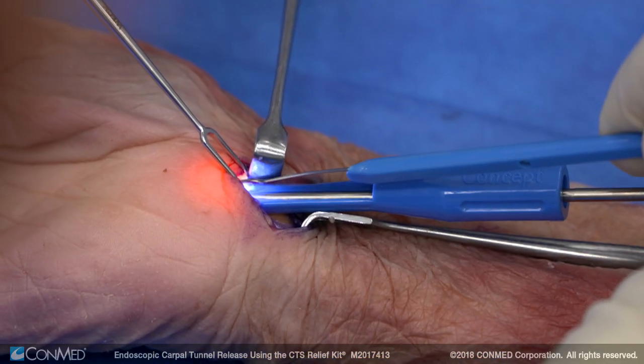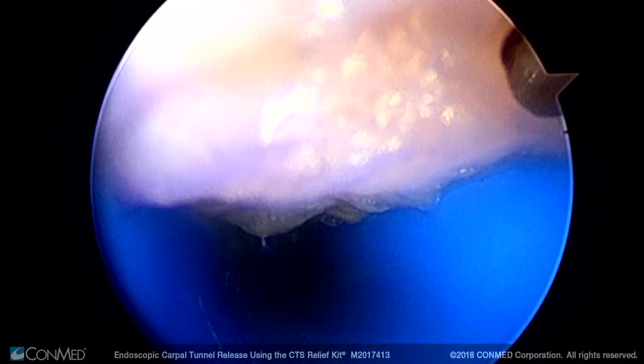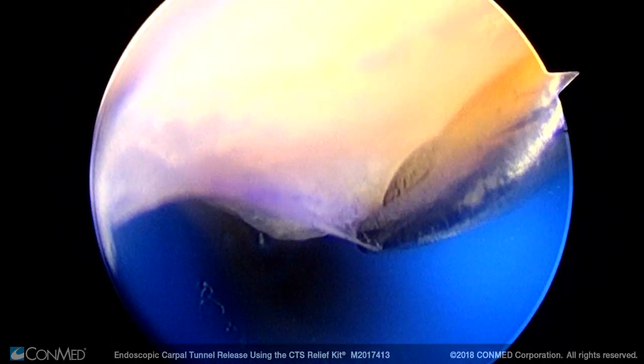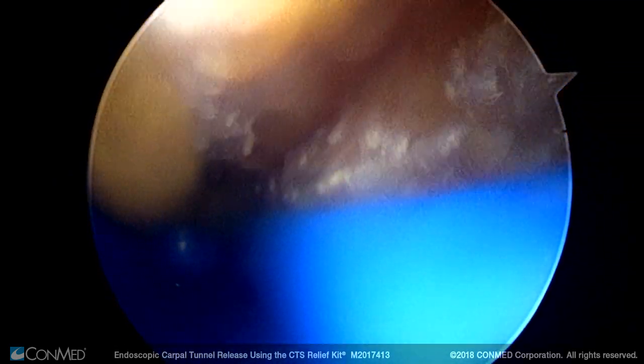The system comes with a blade that we're going to use to cut the ligament. Here's the edge of the blade — you can see it in the top right corner — and we are incising the ligament as we're following it down.